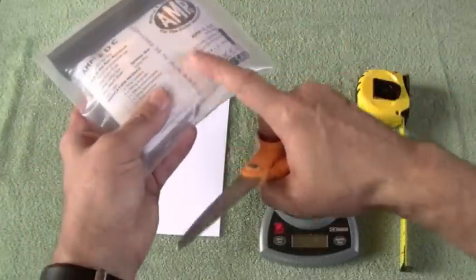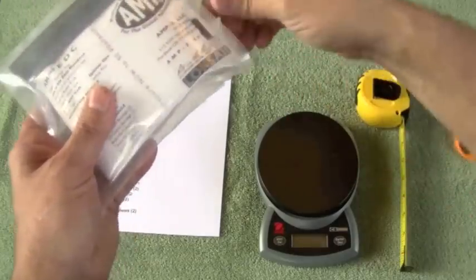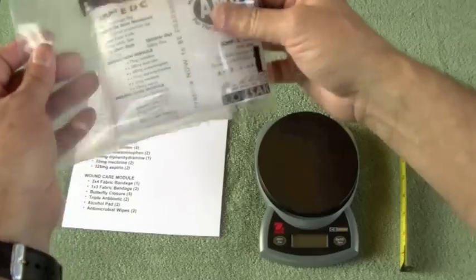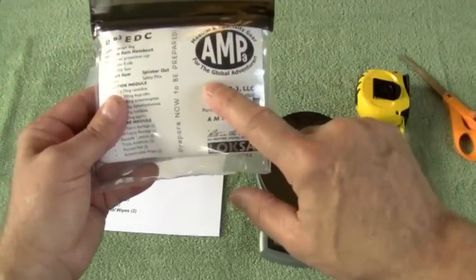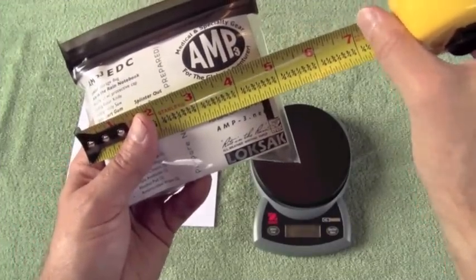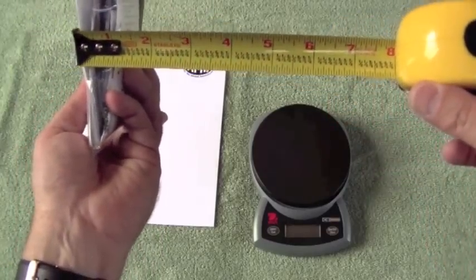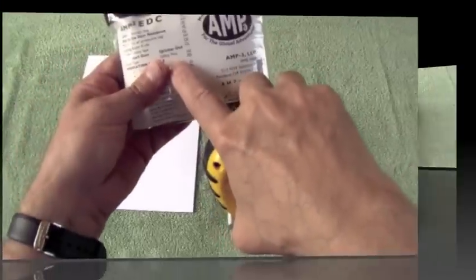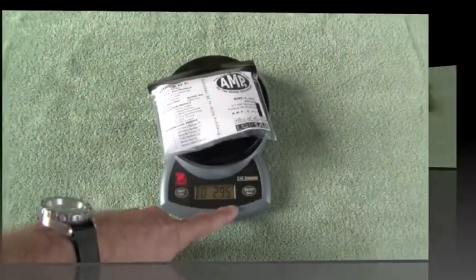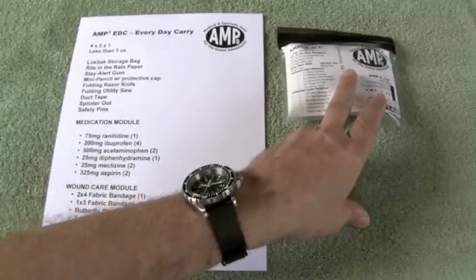All of our kits come with this heavy-duty 4 mil poly overwrap bag — be careful when you open it so you don't damage the kit. It just provides extra durability. The AMP 3 EDC measures about five inches wide, four inches deep, and just about an inch thick, weighing under three ounces. Here's a quick look at what's inside the EDC.